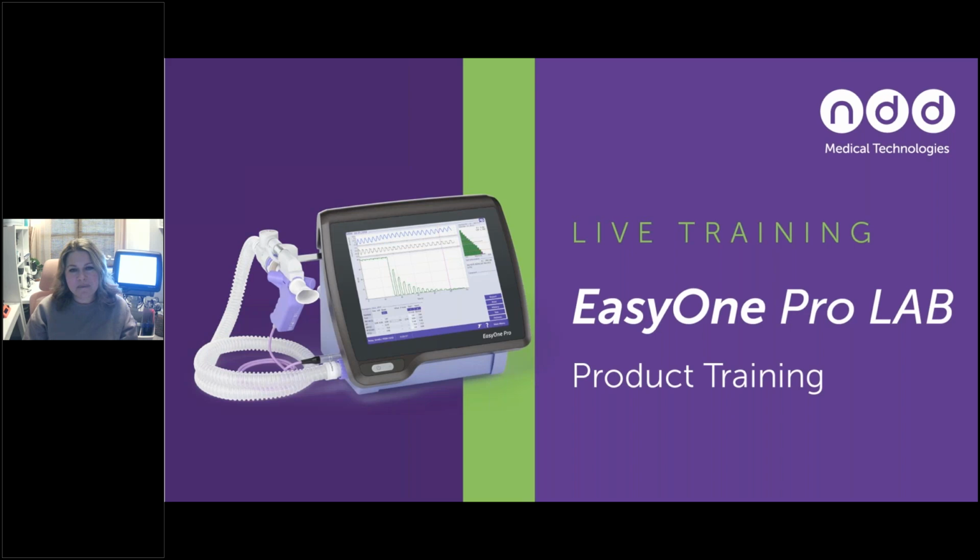Yeah, and I don't know if this is a question, but it says we can get TLC and FRC results on SVC ERV method with the washout, I'm guessing. Okay, so yes. Like I was saying, on the SVC, always add your IRV and your ERV to the parameters that you see as a technician doing the test. Because especially with the IRV method, obstructed patients are going to have a hard time getting all the way back down below baseline. And if you do not get an ERV in your SVC, it is not going to carry over and give you a TLC in multiple breath washout.